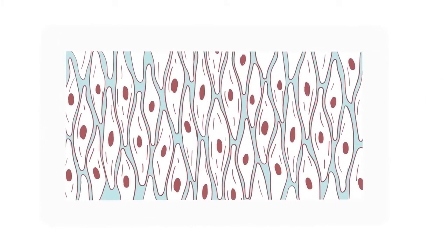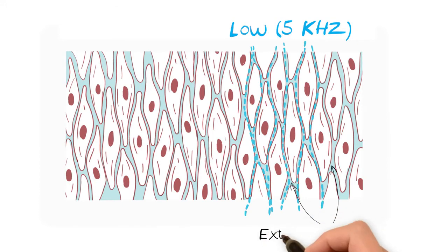So, at low frequencies, any current conducted through a body is passing through extracellular fluids only. This allows the measurement of only extracellular water in the body.